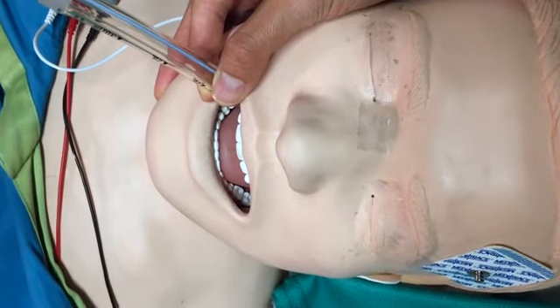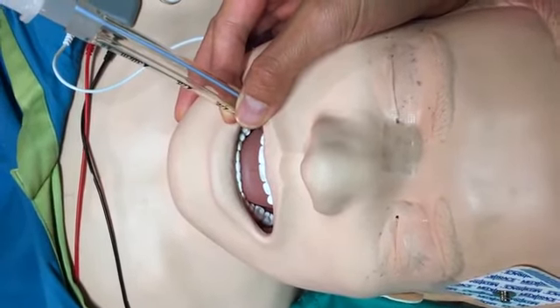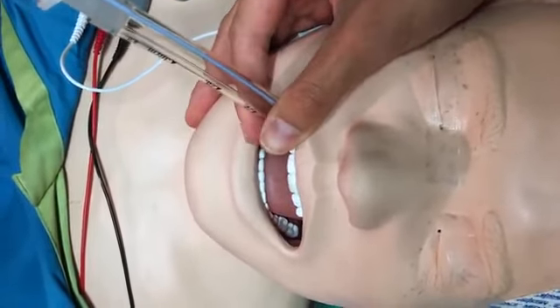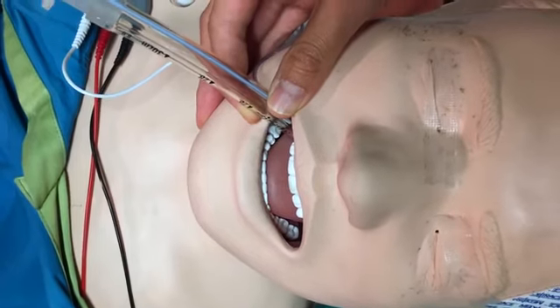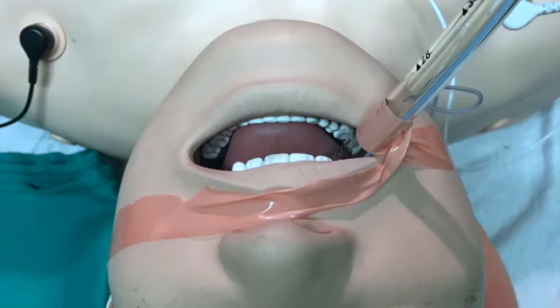To secure the ET tube, you want to make sure it's on the appropriate side, possibly the non-surgical side if possible. The ET tube will be secured between the molars and the lateral aspect of the tongue, so it'll be the paraglossal groove, kind of around here. Make sure the soft tissues are free of pressure, and make sure to tape it securely. Now I'll have a picture of what that looks like.